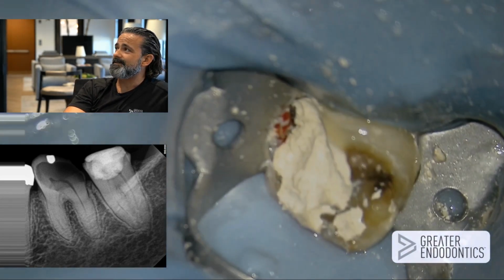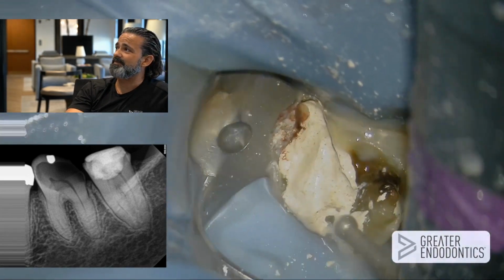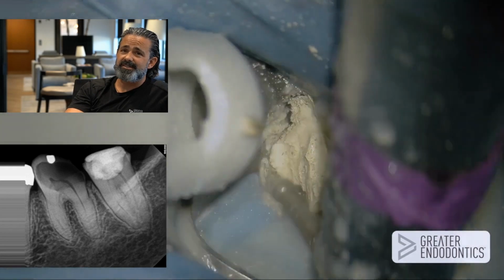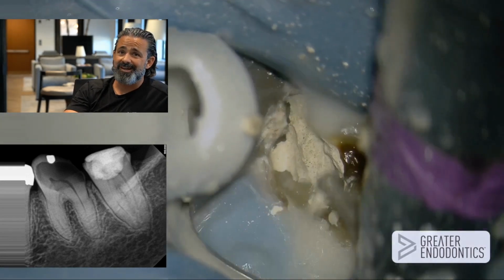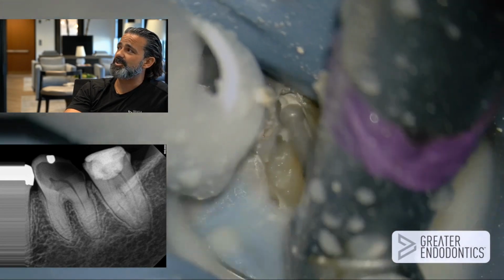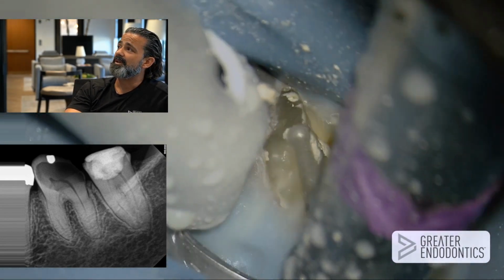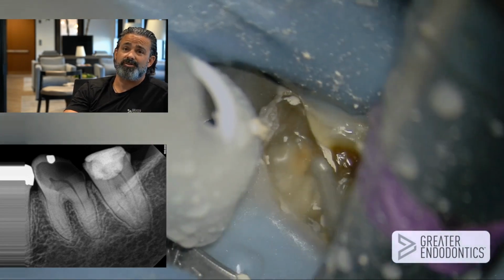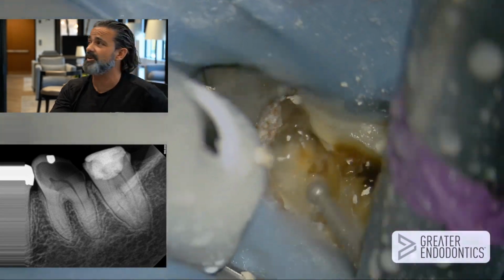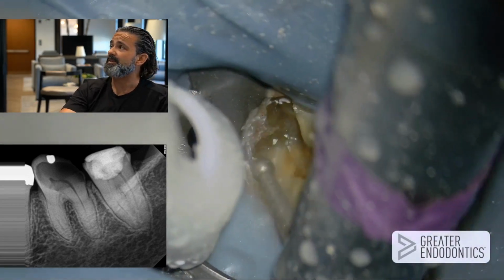So, 101 stuff, right? I'm removing the IRM, getting it focused. You can see that I did single tooth isolation. It wasn't like I could use the tooth up ahead to help with the isolation. And so it raises a lot of questions about how I'm going to build this sound seal platform, or do I abort and not even consider using the GentleWave? But I wanted to use the GentleWave because I didn't want to compromise on my care, in my mind.